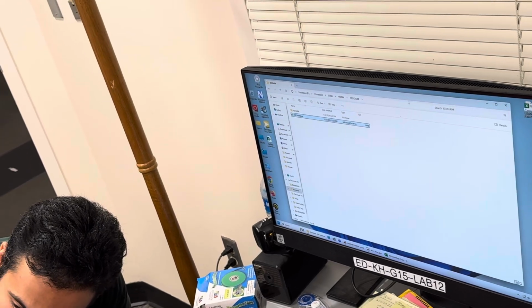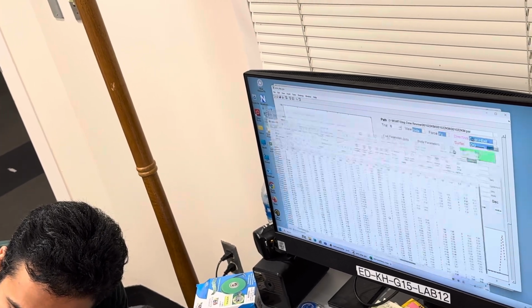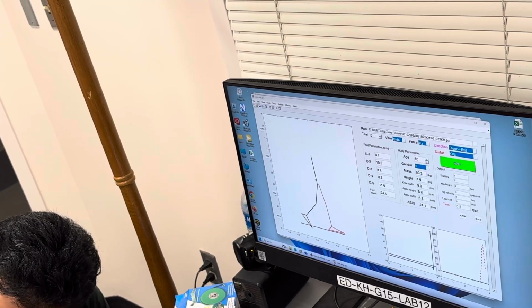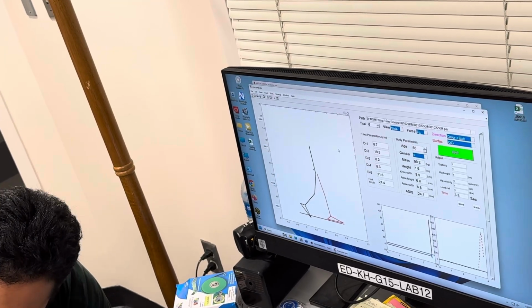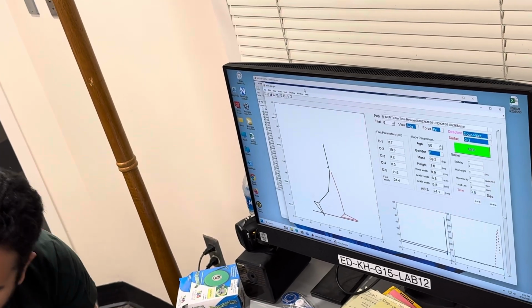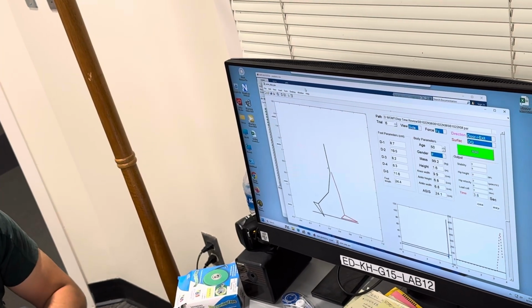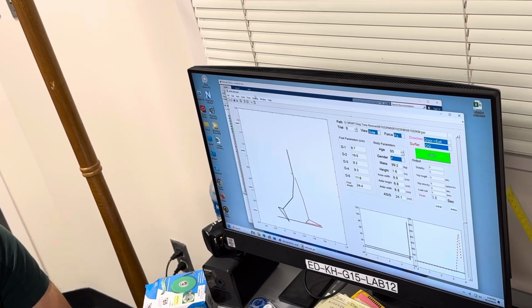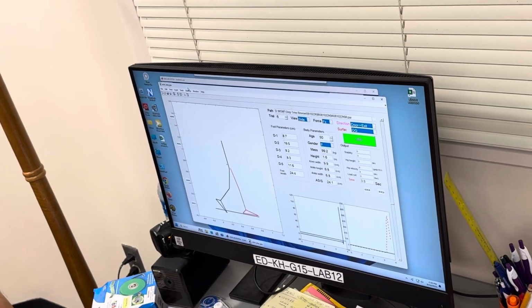If you're doing it all in one sitting, maybe 2 hours, because the overground walking takes the longest. The normal, fast, whatever walking speeds take the longest. The treadmill parts are pretty easy, but the overground walking takes a lot longer to process.